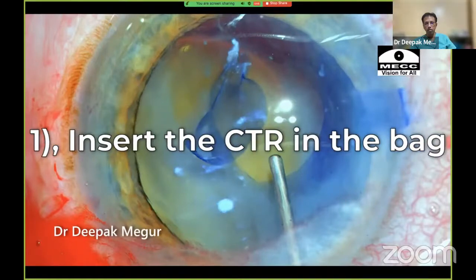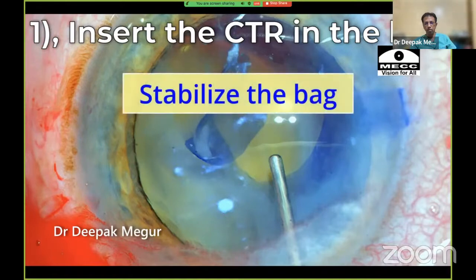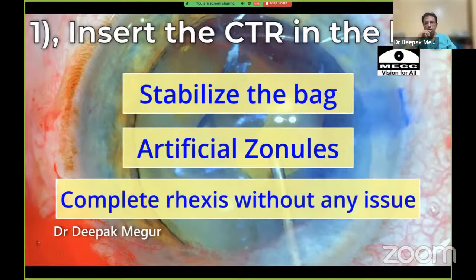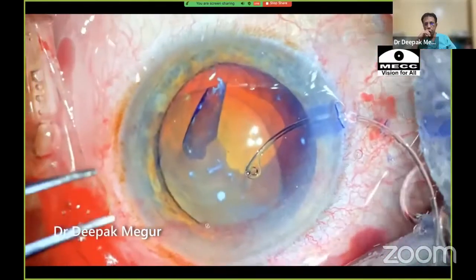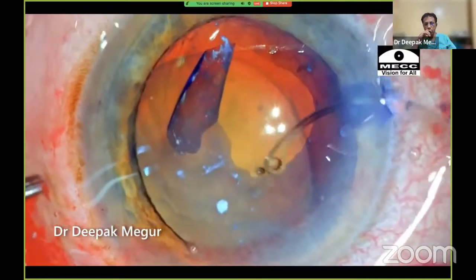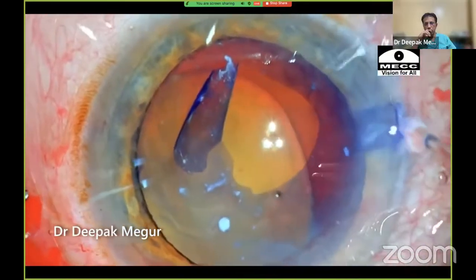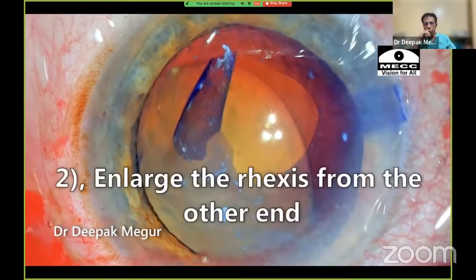I wanted to stabilize the bag before completing the rexis. Option one: insert the CTR, which would help the bag regain stability — the ring would act as an artificial zonule, allowing me to complete the rexis with greater ease without causing further damage. However, during CTR insertion, the weak zone could give way and extend to the periphery as the ring tugs at it, risking loss of the rexis. That concern made me choose option two.